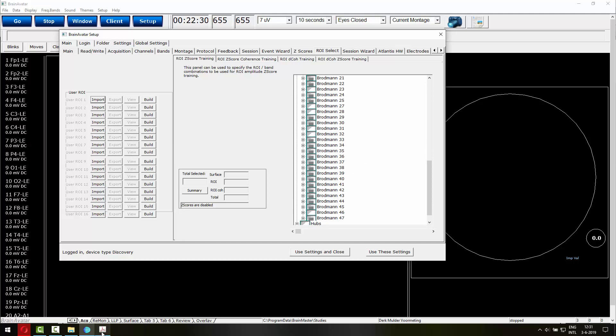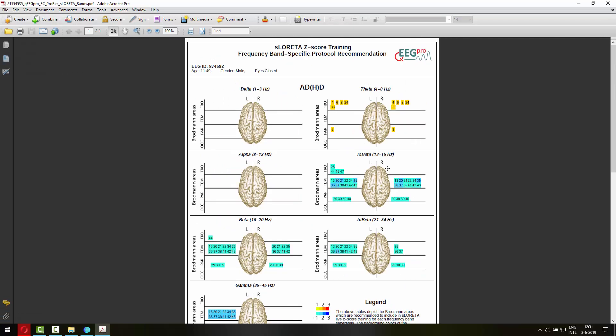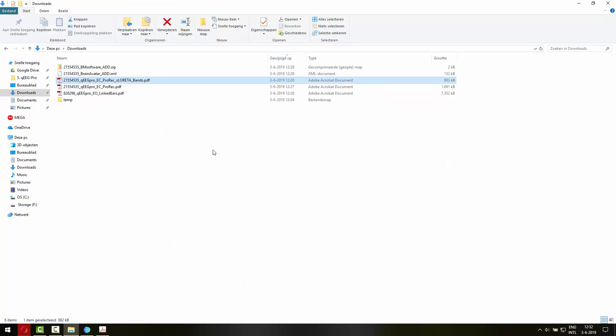And that's the case for all the Broadman areas that are selected here. It's an exact copy of what is presented here. So that makes it really easy to make your protocol in Brain Avatar. For the classic neurofeedback settings, it's a little bit more complicated.